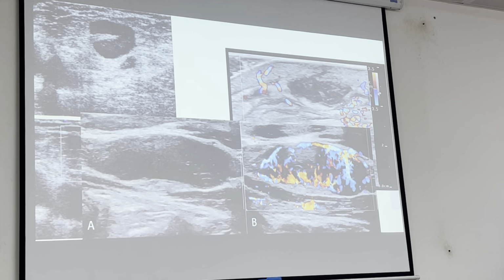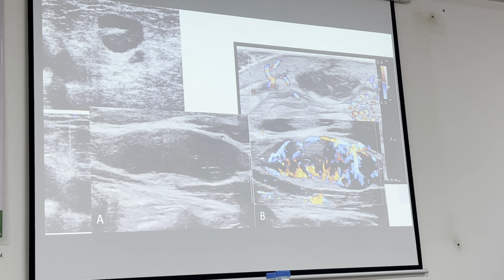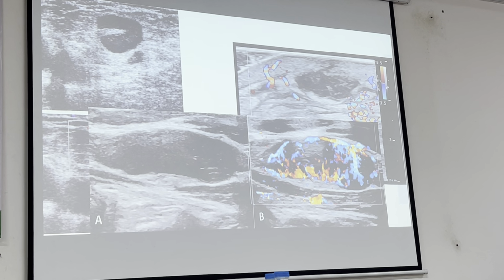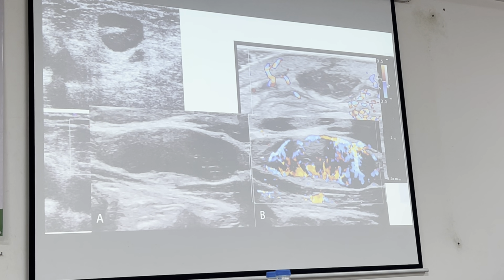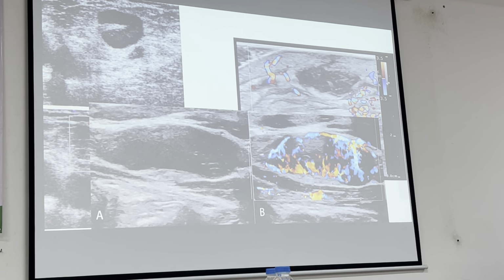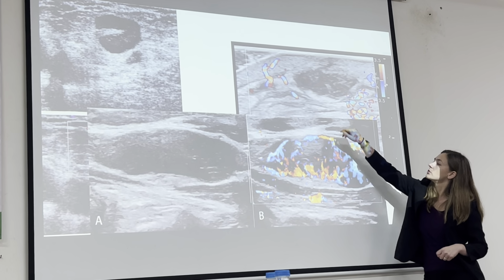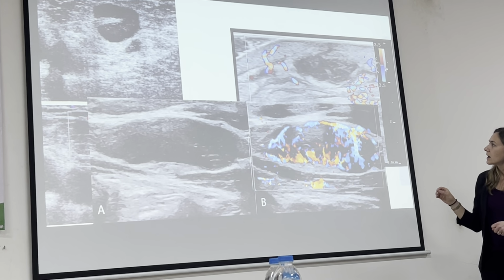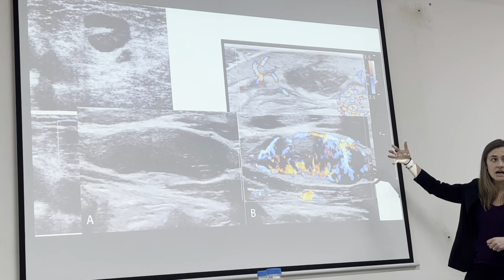It has some irregular margins, whereas in the lymph node, these margins are pretty clear around. Additionally, we talked about the shadowing behind it with the hyperechoic borders. So posterior here, we'll go back, you see the hyperechogenicity, so it's brighter behind the abscess.